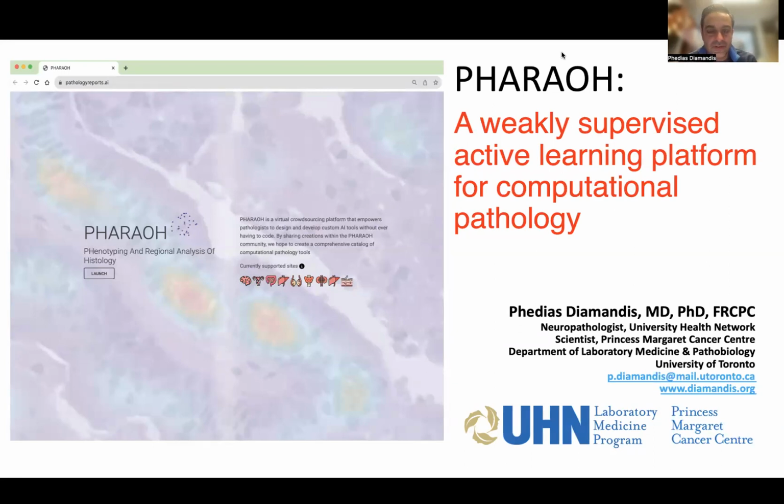Thanks for the invite to present some of our latest work on computational pathology. Today I'm going to be presenting a platform that we've developed for the community to help grow computational pathology, called PHARAOH, or Phenotyping and Regional Analysis of Histology, which is a website that you can access right now.